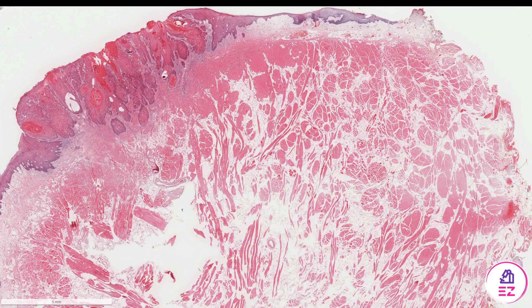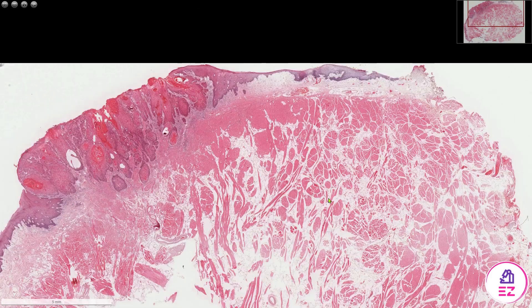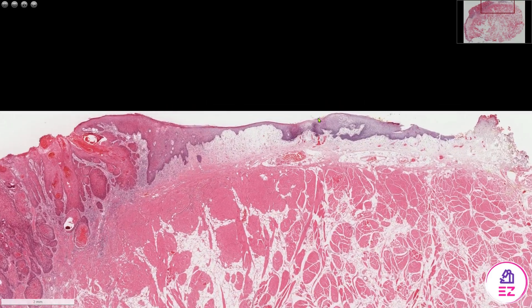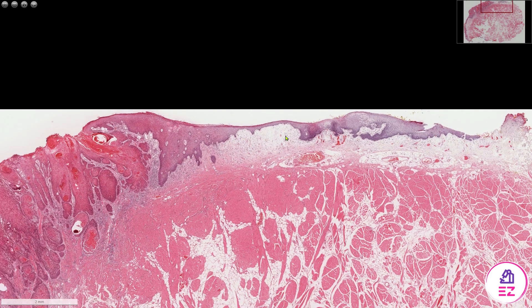Hello and welcome to Path Made Easy. Today's example is an oral squamous cell carcinoma occurring on the tongue. At the deep aspect we can see muscle and adipose tissue, and on the surface, at least in this location, we have normal stratified squamous epithelium.